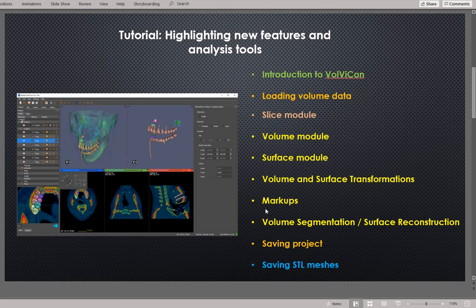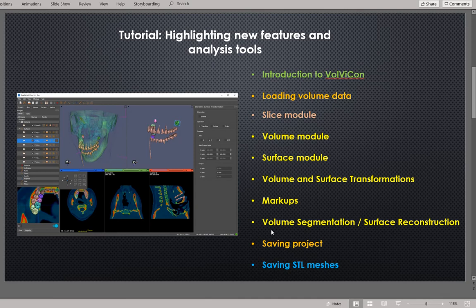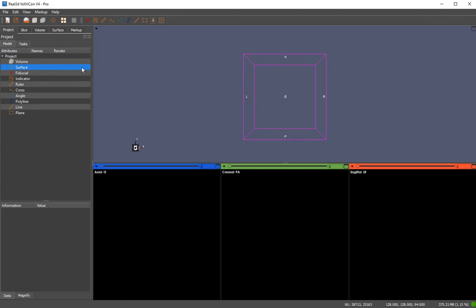I will also draw some markups, perform operations with markup, do volume segmentation, and reconstruct a surface model from volumetric data. In version 4.2 you can save the whole project — including multiple volumes, surfaces, and markups — and reload it later. At the end I will save STL segmented meshes. Let's get started. This is the default interface of Volvicon.